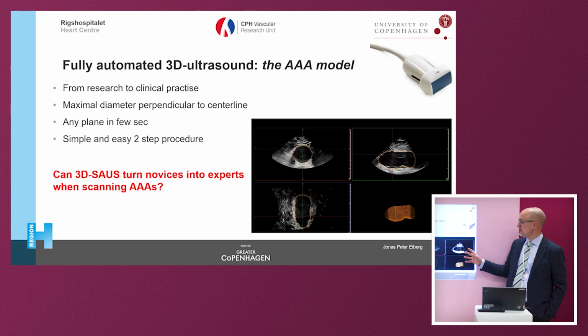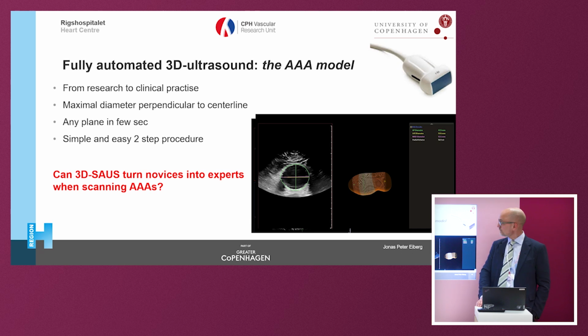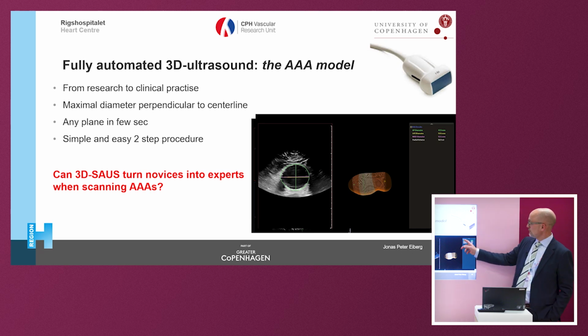So based on this, it looks nice. We discussed, would this technique be able to make novices into experts if it is as good as I say? You can see it just spits out the diameters here.